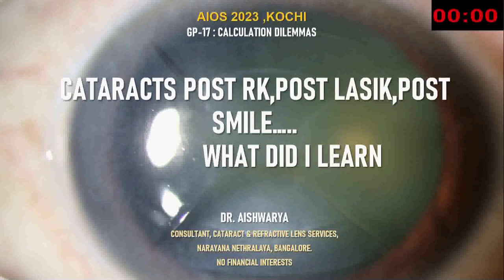Once you do multiple scans, it looks like it's not changing. These are all the things I'm telling about in young patients. In older patients, usually the KC is already stable, so you don't have to worry about it.